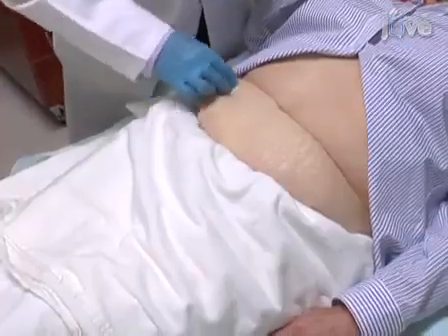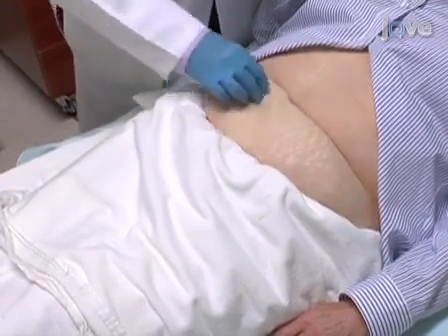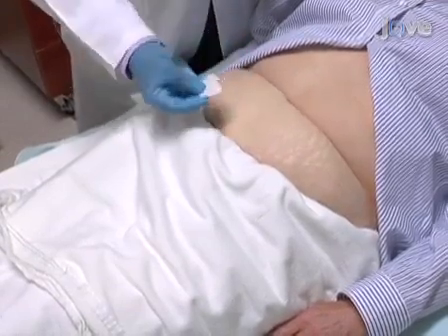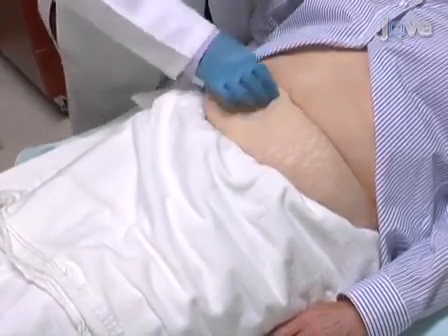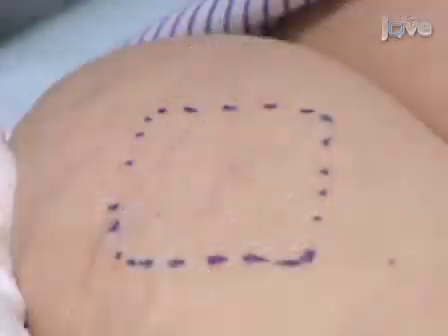Using alcohol swabs, clean the skin on the lower quadrant area of the abdomen, lateral to the midline and below the umbilicus. Mark a rhomboid shaped area about 2 by 2 inches with a marking pen.